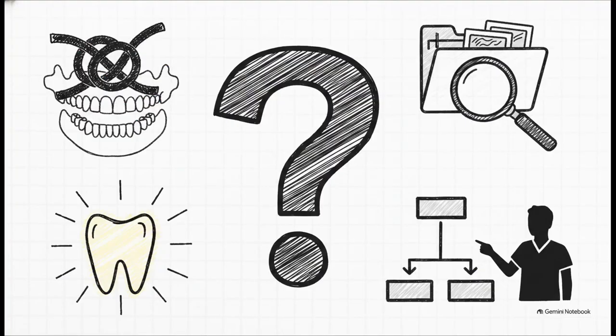So, how do you actually decide which contender is right for a specific patient? The reality is, there's no universal magic winner that fits every single case. Your choice depends entirely on 4 practical factors. First, case complexity. How difficult is the anatomy we're dealing with? Second, available diagnostic data. What kind of imaging do you already have on hand? Third, restorative goals. What is the exact intended outcome? And fourth, your own workflow preferences. How does your practice naturally integrate new tools into daily operations?